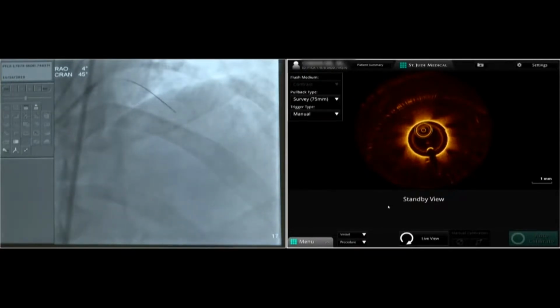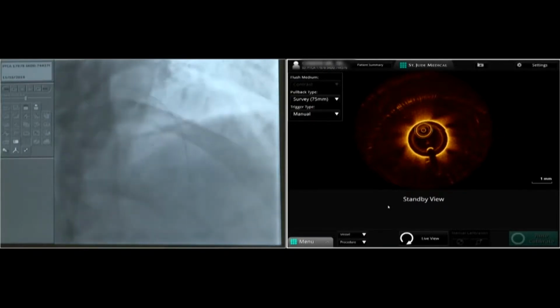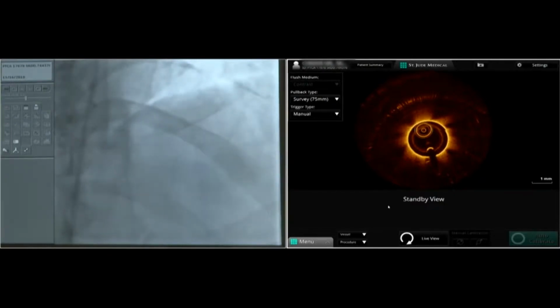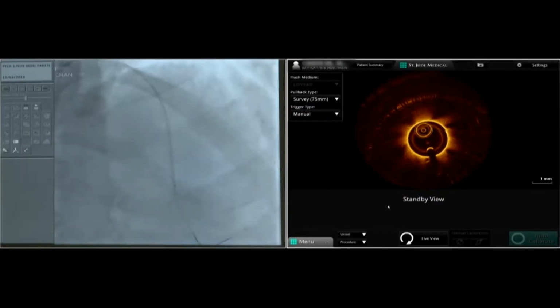So we would do an OCT of this lesion and then size it, and accordingly then we'll prep the bed as for any absorbable technology, and then we would do an optimization again with the OCT technology. So you're using imaging not only to size, but also to look at the properties of the plaque in order to do the appropriate PCI. Yes, that's right. Absolutely.